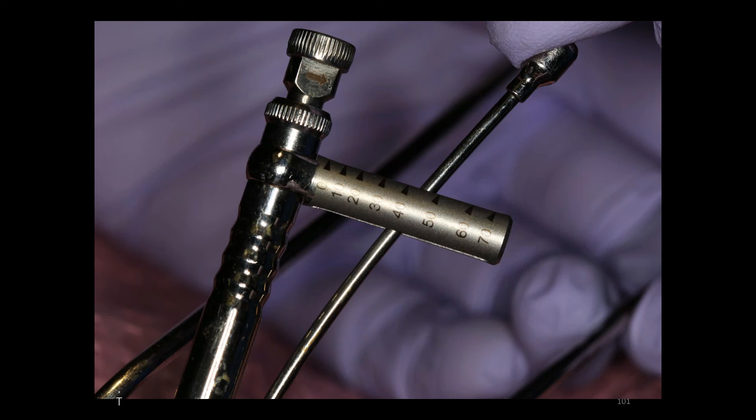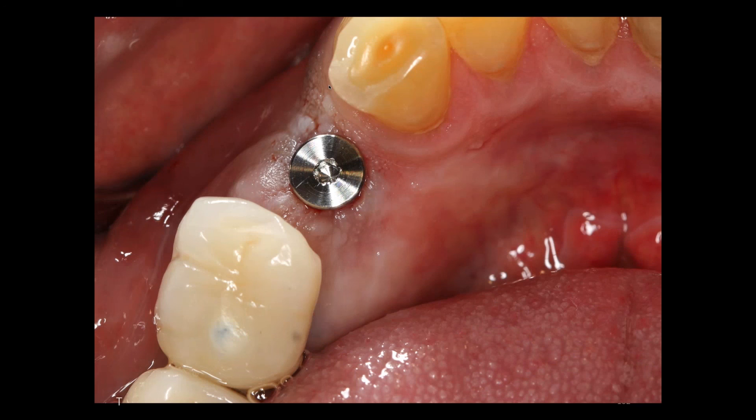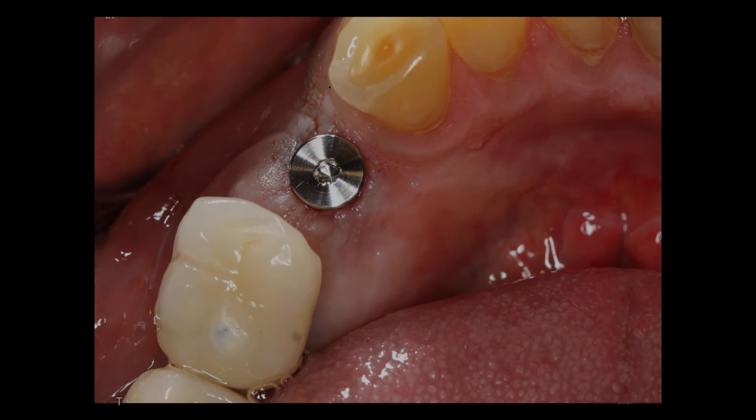For those of you who are not placing implants, we have some wonderful courses that Kurt can describe to you a little bit later. The implant is placed, the healing abutment is placed, and we can restore that in the future. So I think we can all agree — you can do this. It's probably the most basic grafting technique, and it's better than doing nothing.